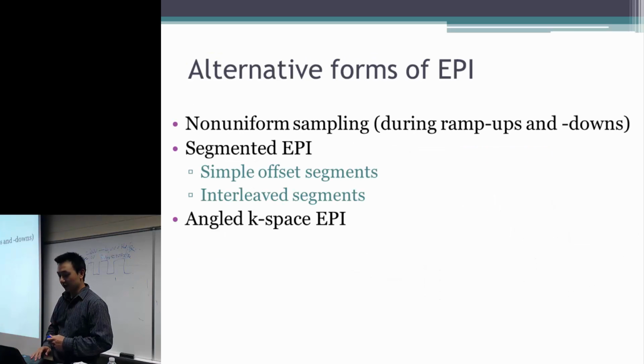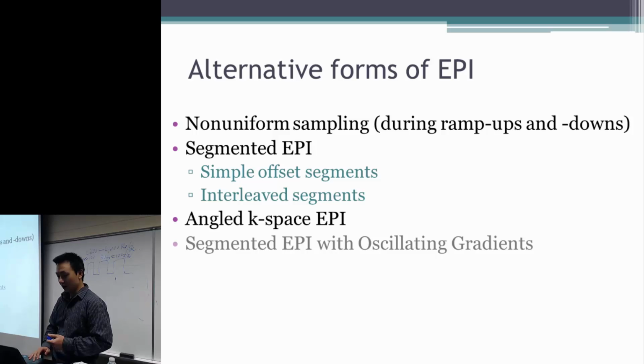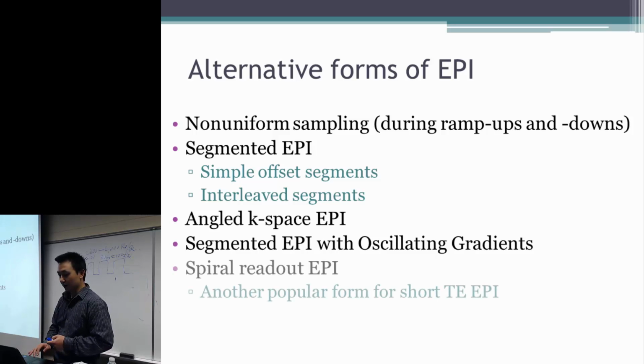Okay, so there are just some alternate forms of EPI. Some people try to acquire even faster EPI scans, so they collect the data during the run up and run down times.